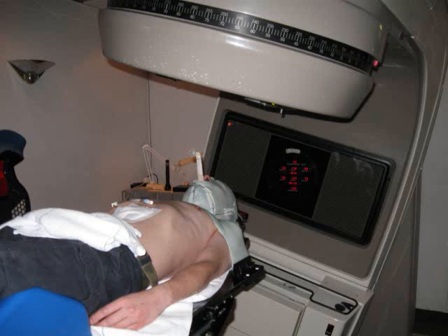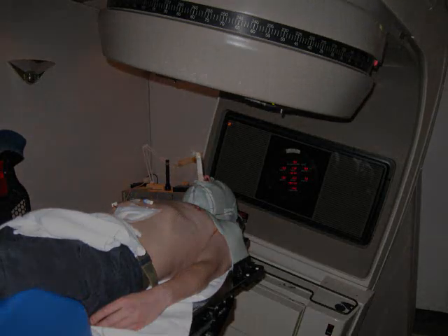This is my friend who is undergoing radiation therapy for mouth cancer. This time I put my camera into a black box which he was wearing around his belt, so I could record the high-energy photons striking the camera CCD.